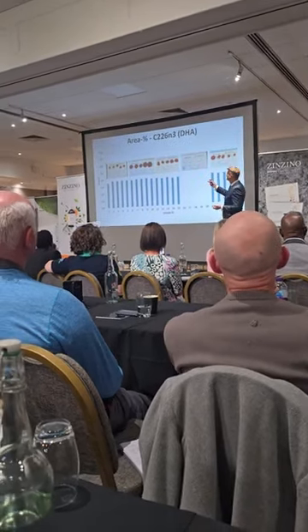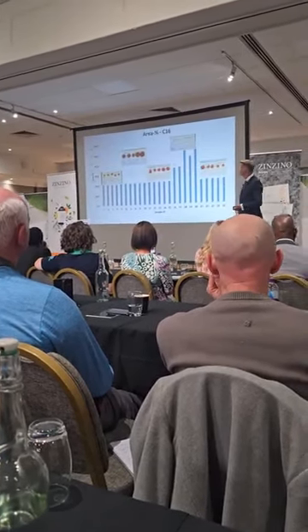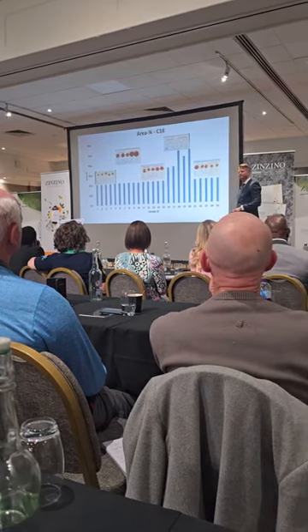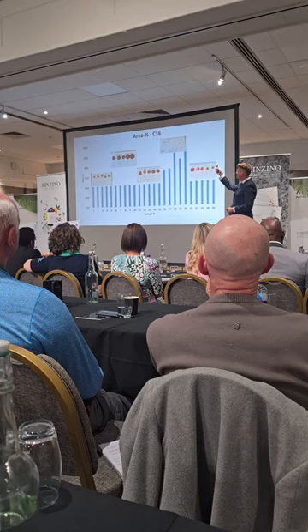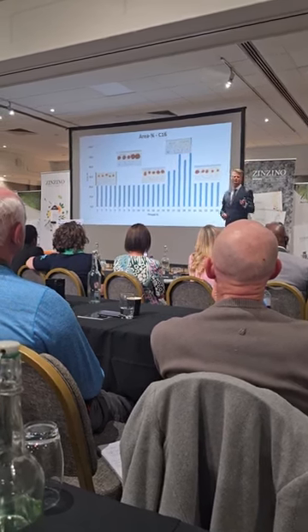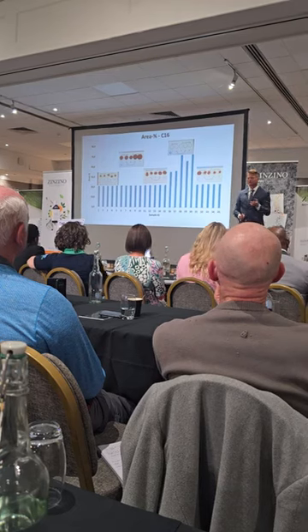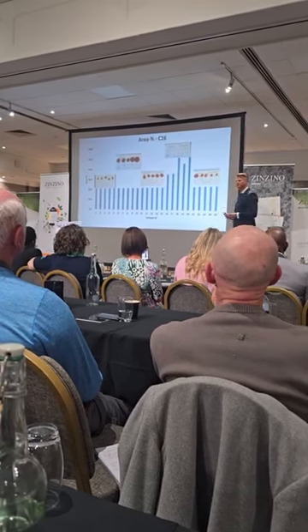Of course, this is because there is no DHA on the paper, right? But look at this one. No blood, high result. How come? This is not DHA, it's C16, a saturated fatty acid. It's very common. You will find it in any type of fat, like butter, hand cream. So what do you think happened here?